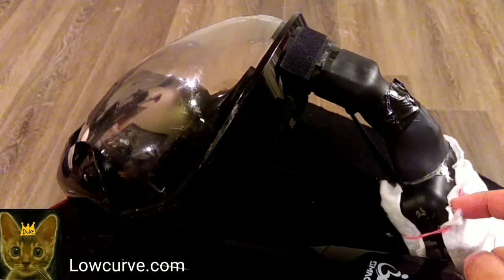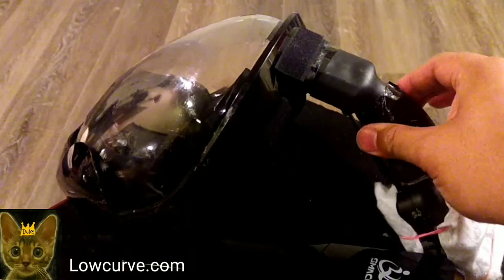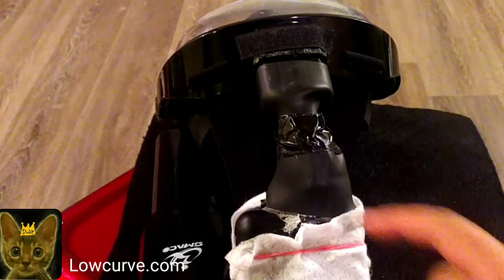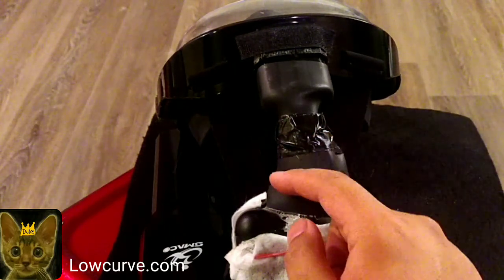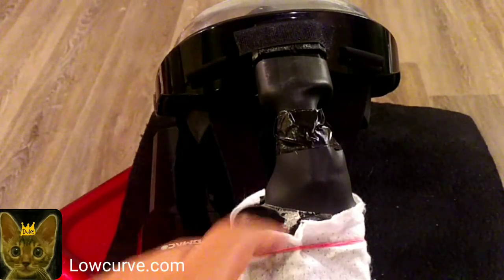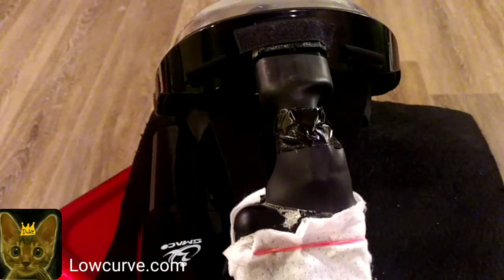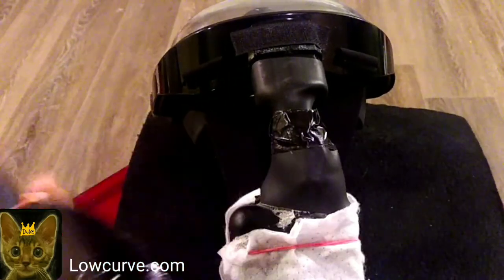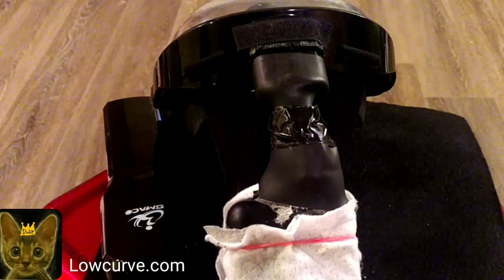Now that you have a piece of CPAP tubing sticking out, you would connect your intake module to another piece of the heat shrink material. At this point, you'll notice that the heat shrink material is actually really rigid. So once you have this in place and you put them together, they'll just sit on your table like that. The final heating around here is actually really delicate, so you're going to have to take some time with the hair dryer. The connection here, which I still had to reinforce with tape, is a lot easier because it's just sitting up, positioned with both ends of the CPAP tubing where they need to go. Okay, so that's pretty much it. It would be a lot easier if you just repurposed the original snorkel for this, so you'd only need one side of the heat shrink tubing, but that's up to you.